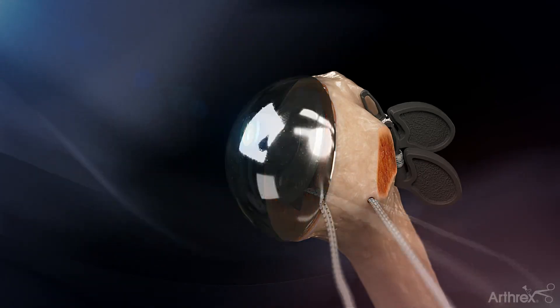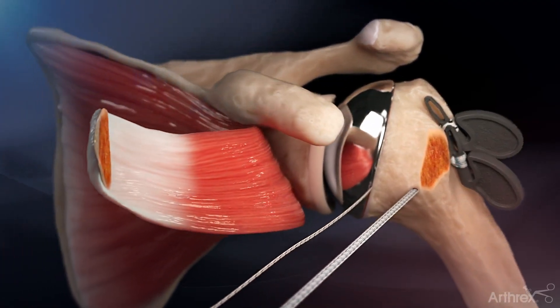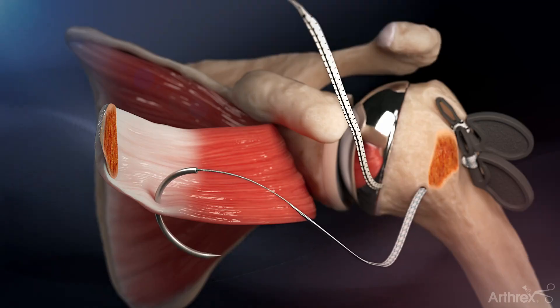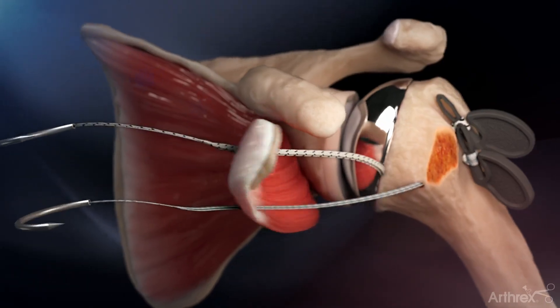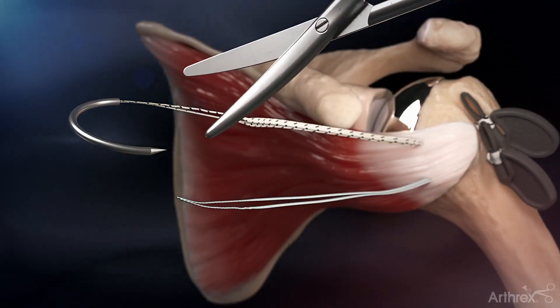The humeral head component is then placed on the humeral stem and the humerus is reduced. Using the attached needle, pass the inferior sutures through the subscapularis tendon, followed by the superior sutures in the same manner. The needles are then cut from the sutures and discarded.